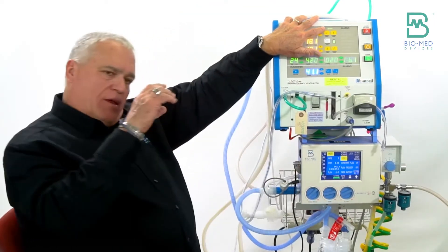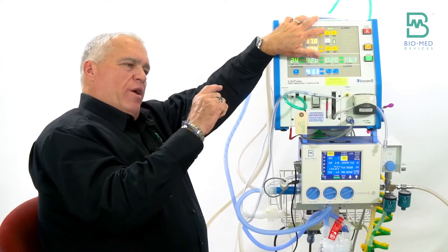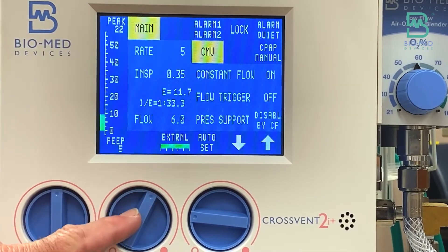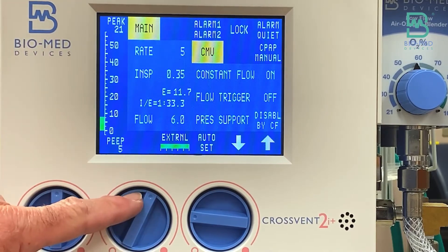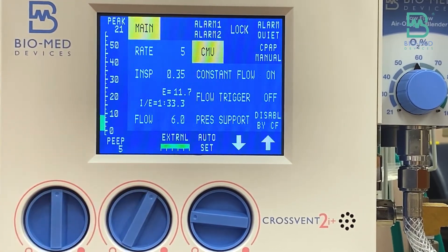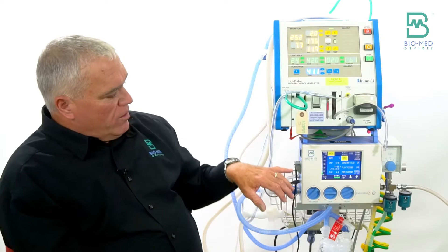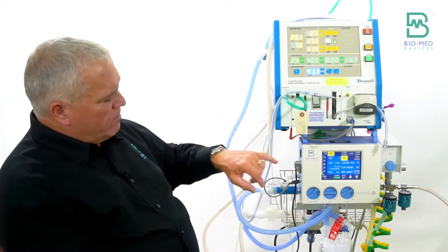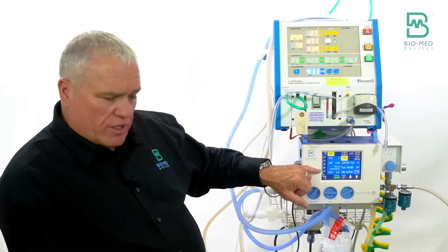If you notice on the bar graph, it's bouncing because you can see the jet pulsing. The PEEP numeric value only gets updated when conventional breaths happen. The best way to read PEEP is to look at the bar graph — it's solid green up to a point and then bounces above that point. That lowest point is really where your setting is. So set the bottom of that bounce right where you want your PEEP — for example, seven and a half.